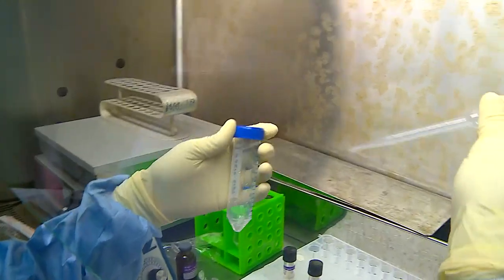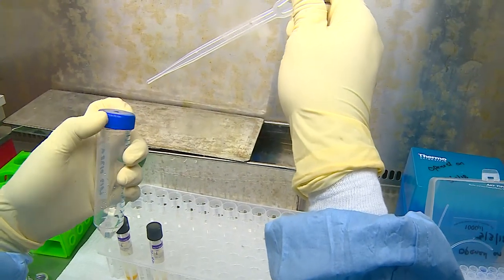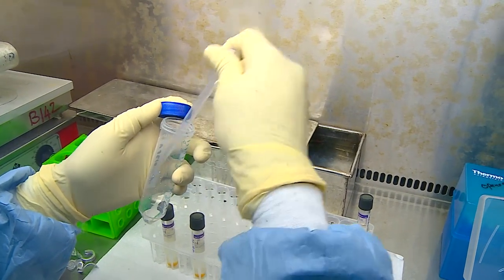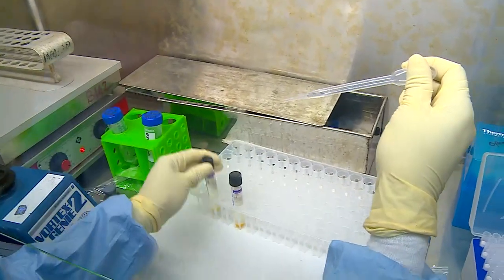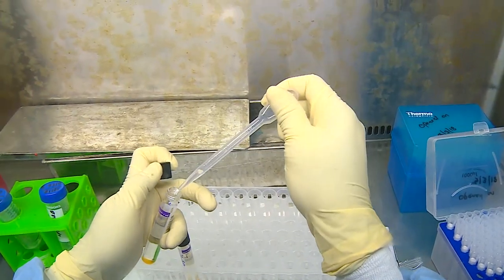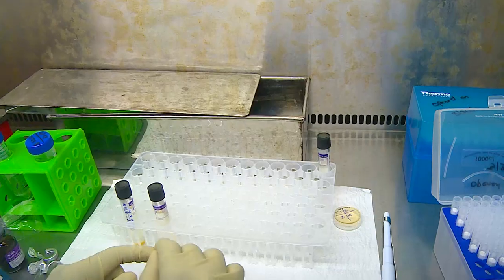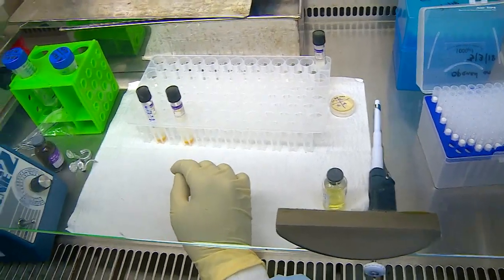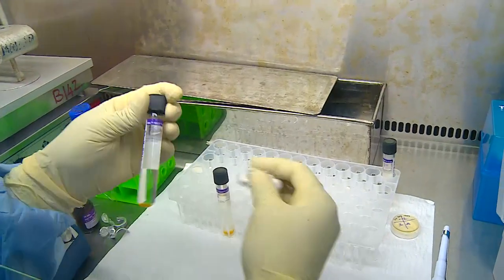Mixing well ensures that a uniform deposit is added to the tube. 0.5 ml is taken using a sterile Pasteur pipette up to the 0.5 ml mark and is carefully added to the MGIT tube. The pipette is discarded in the disinfectant bath. Once both the tubes are inoculated, they are ready for loading into the MGIT system.